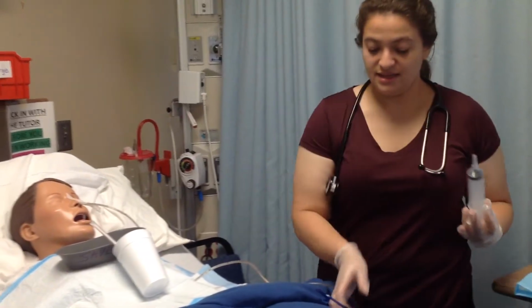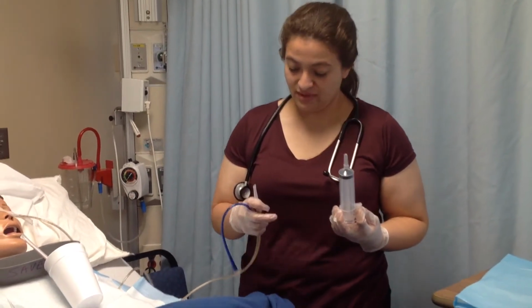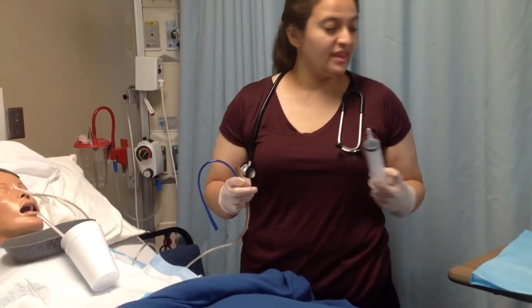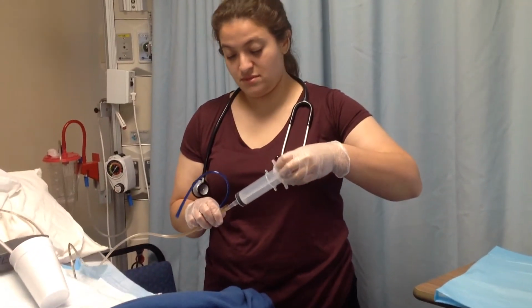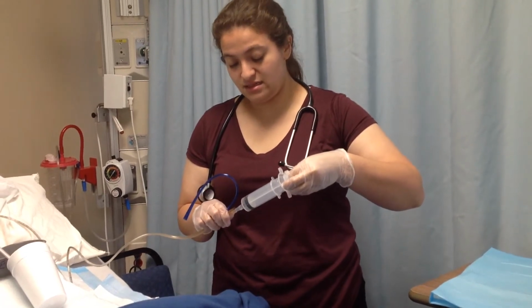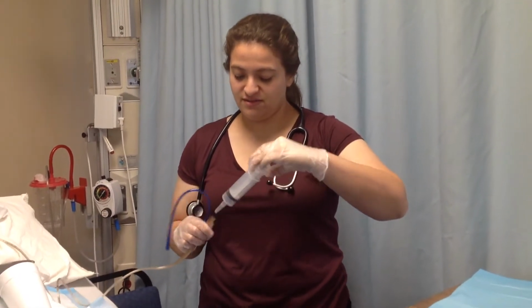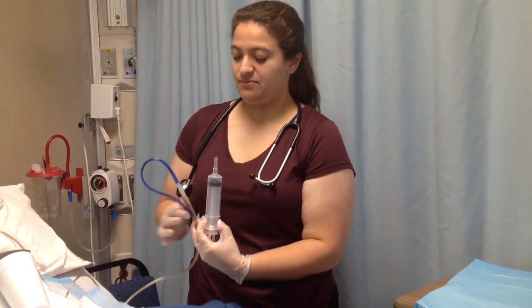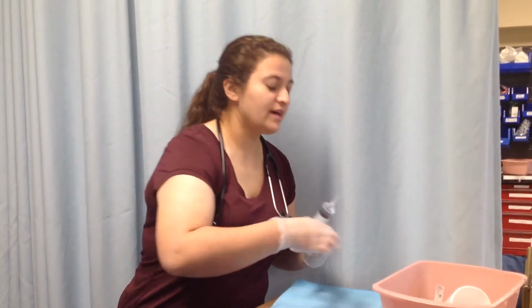And so once I've done that, I would take this tube and unclamp it. I'm going to hold on to that. I would want to take at least enough stomach contents so that I could check the pH level. Once I've got enough, I would make sure to clamp it back up again, and I could place that on the patient's bed. And so once I have my gastric contents, then I would take a pH strip.